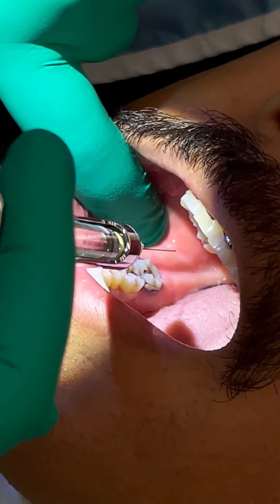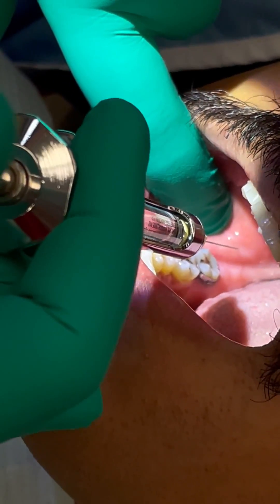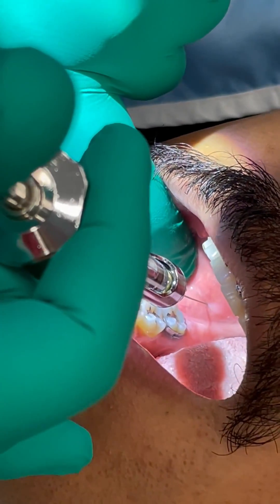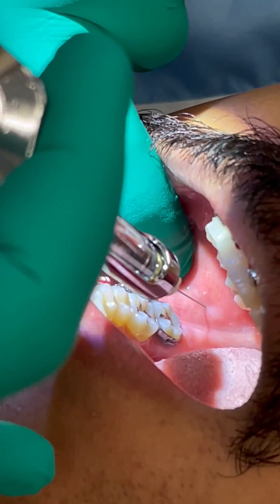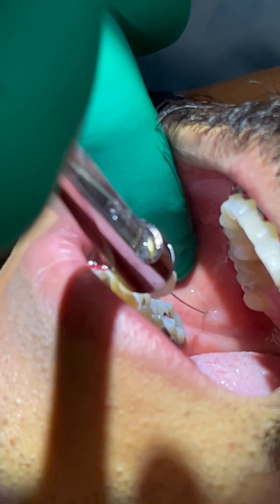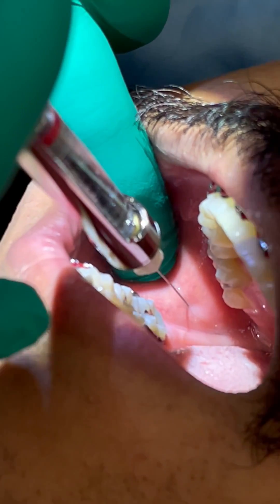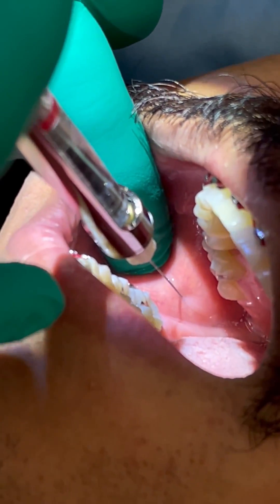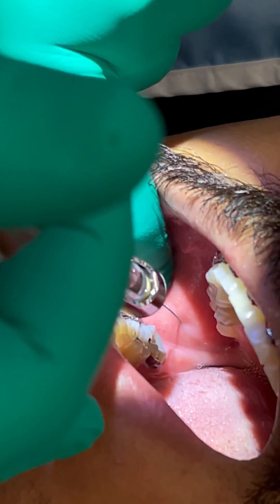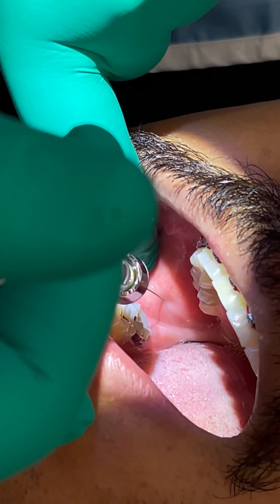You're going to go parallel to the occlusal plane and just straight back into that puffed-up tissue. Like I said, it's barely in — I touch bone immediately. Then you pause, aspirate, and that was negative.